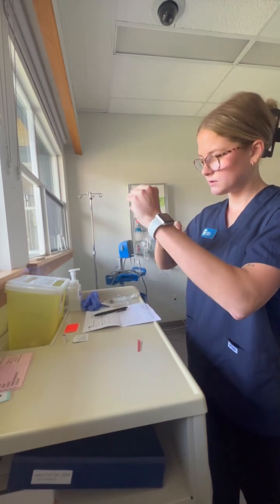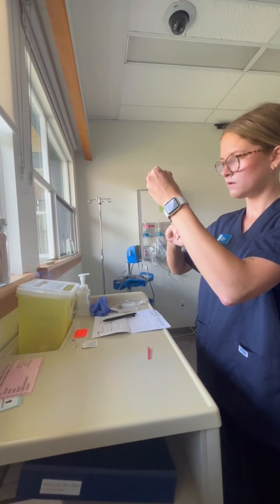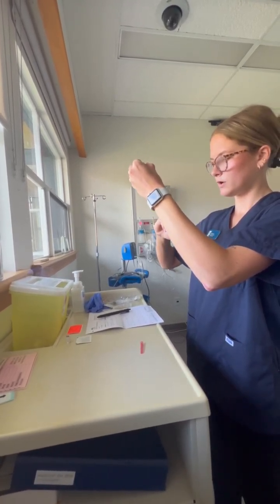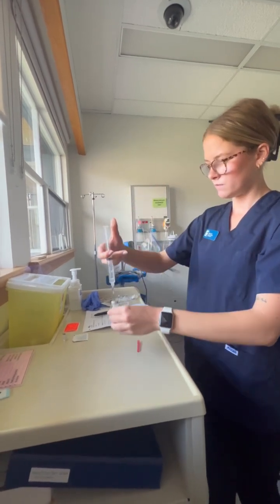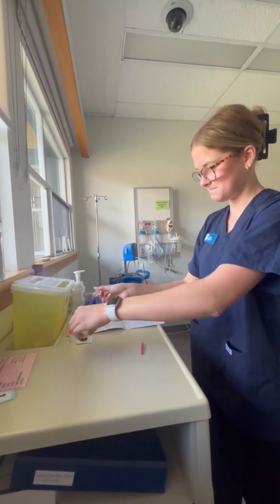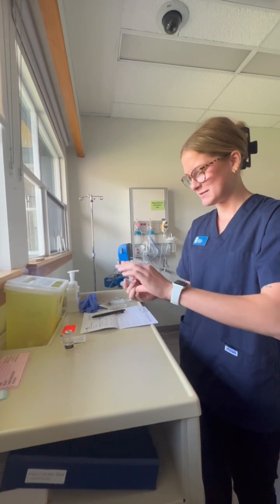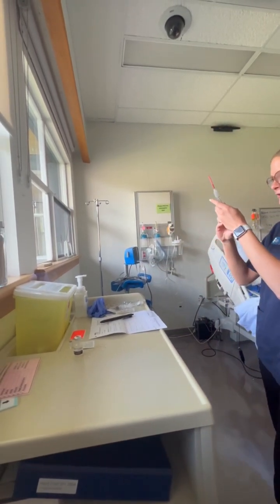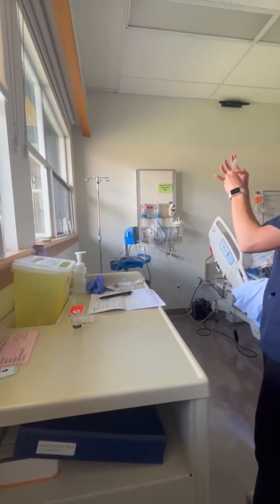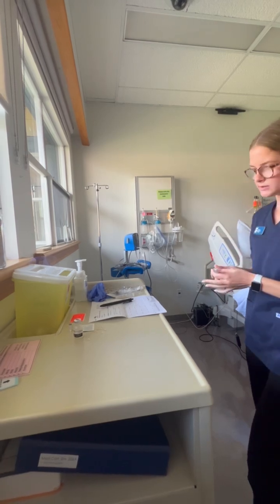All right. It is because it's been used so many times that would happen. Obviously, that would not happen in a real world situation. Perfect. Milliliters, perfect.